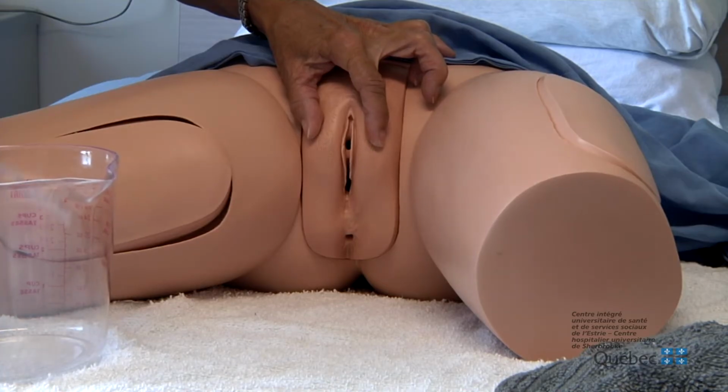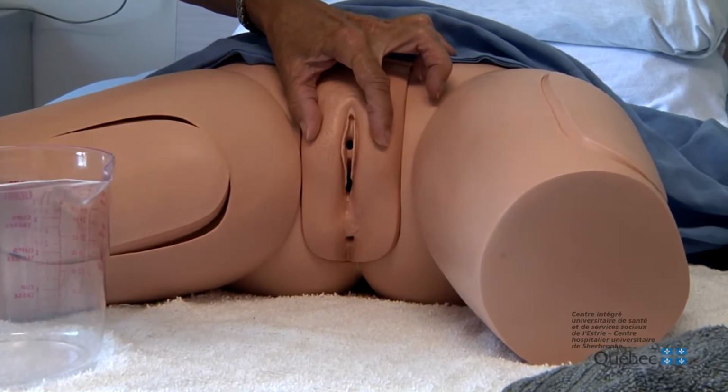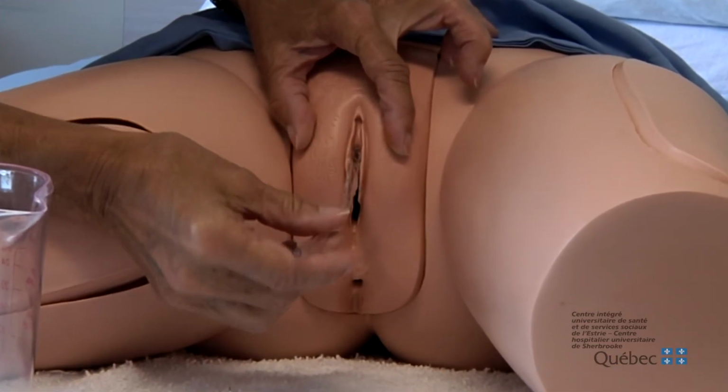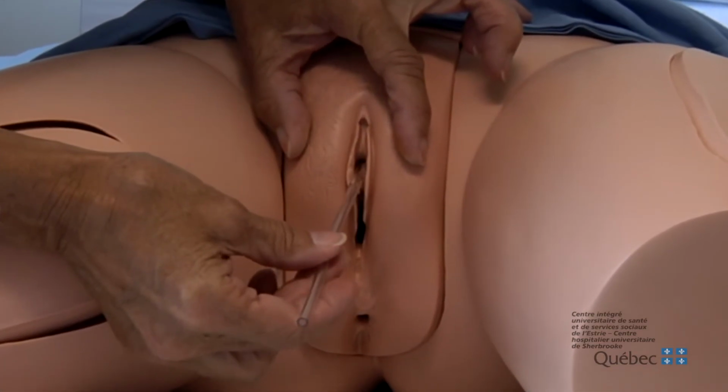Grasp the catheter between your thumb and index finger and slowly insert it into the urinary meatus, guiding it upwards.